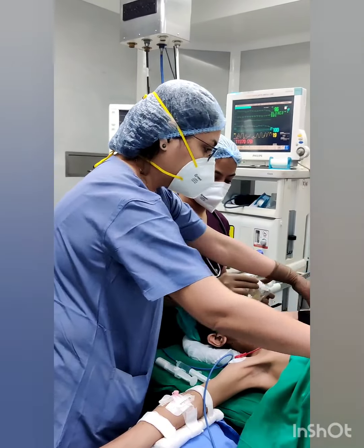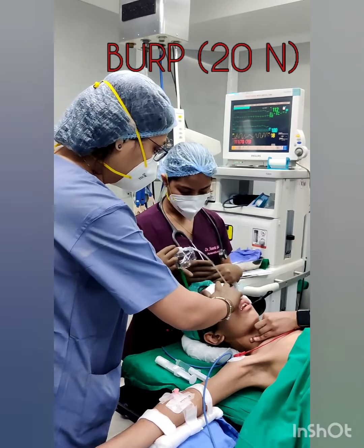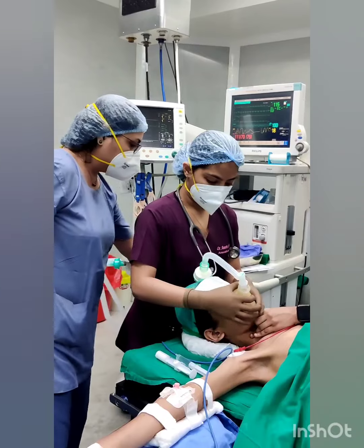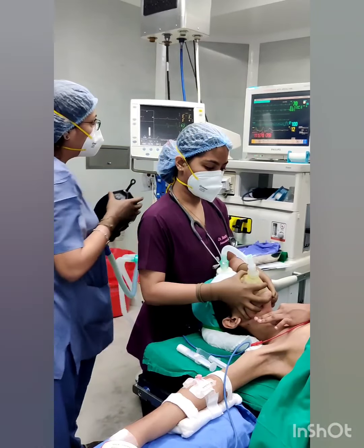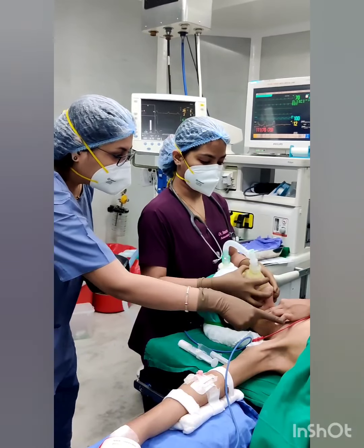IV induction agent is given, and following loss of consciousness, the assistant applies cricoid pressure. It is backward, upward, rightward pressure of about 20 newtons on the cricoid cartilage, which is a circular cartilage that compresses the esophagus below against the body of cervical vertebra and prevents regurgitation of the gastric contents.